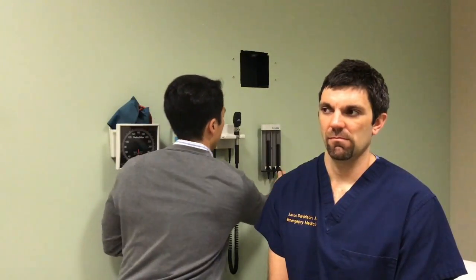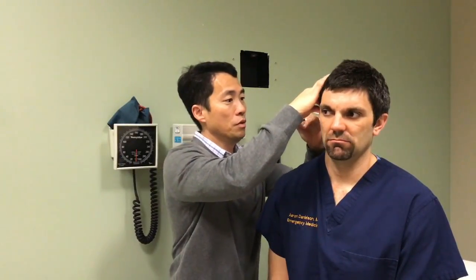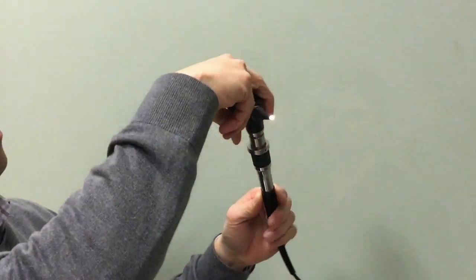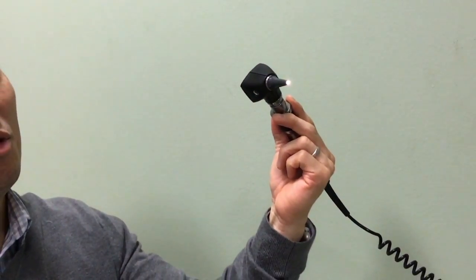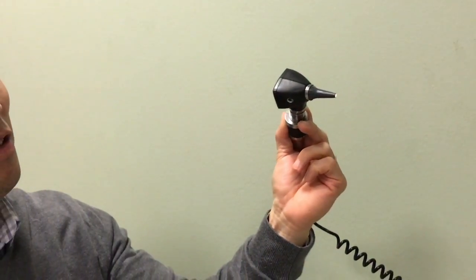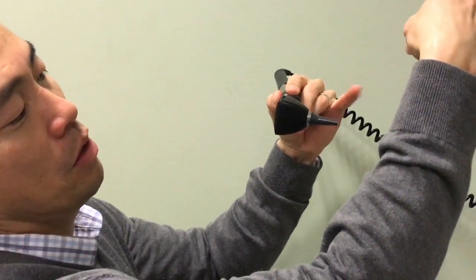Now we're going to demonstrate using the otoscope to visualize the ear canal. After attaching the ear speculum to the otoscope, hold the otoscope like a pencil, using the thumb, index, and middle fingers to hold the otoscope while using the pinky to brace the hand gently against the patient's face. This allows for greater control and makes it less likely that you'll accidentally poke the patient if they move.